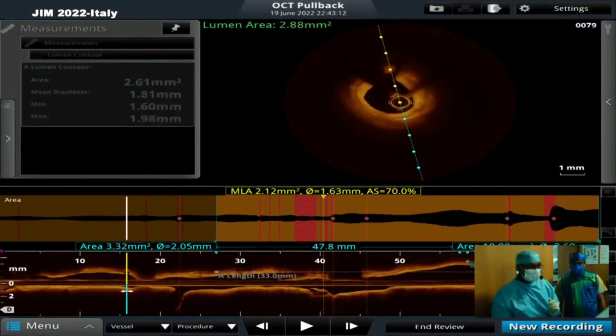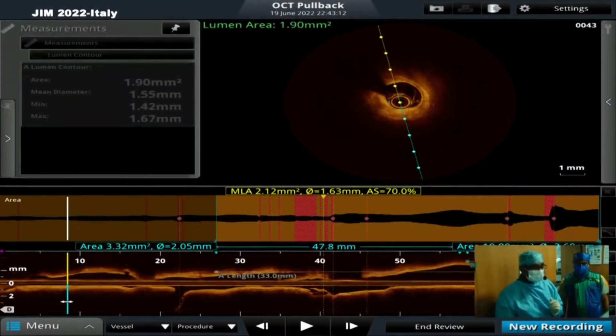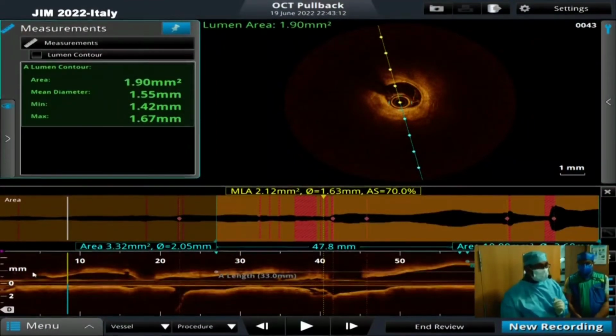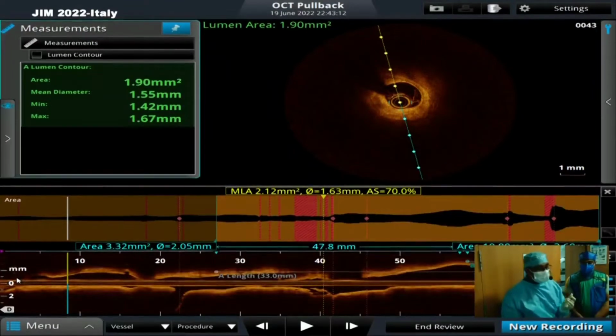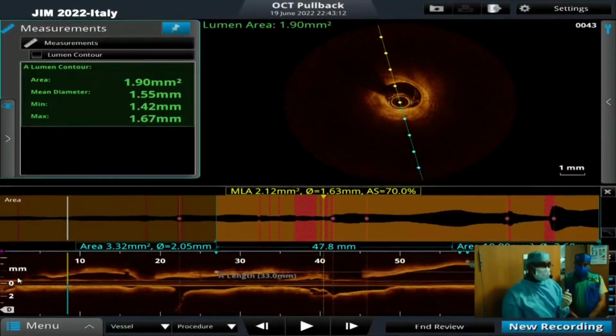That's great. Yes. So we had actually positioned the OCT catheter well beyond the bifurcation. That is, this is the D2, and the OCT catheter was positioned well beyond the bifurcation. Based on the angio, the retrograde collaterals, we had a feeling that the distal LAD is significantly diseased. However, it was not critically diseased.